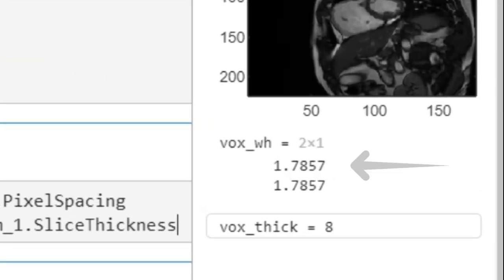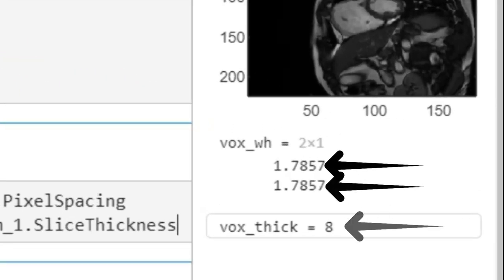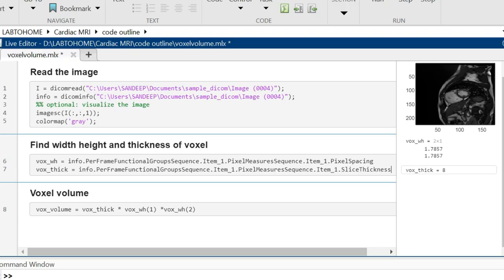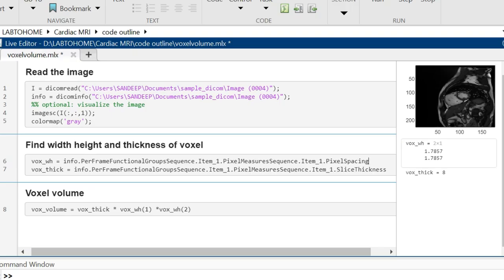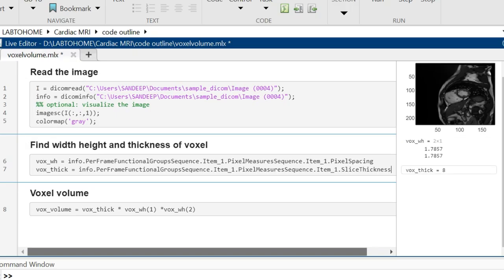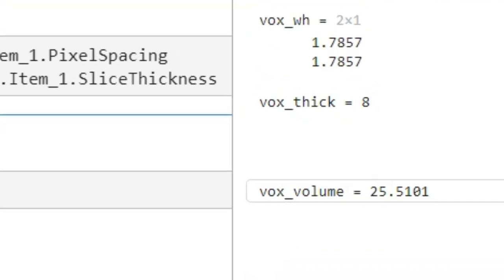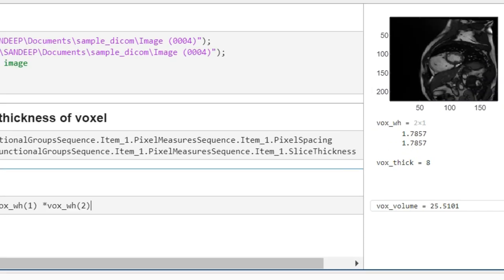Once we have all the three values, we simply multiply them. So width, height and thickness multiplied gives us the volume of the voxel which is 25.5 mm³.